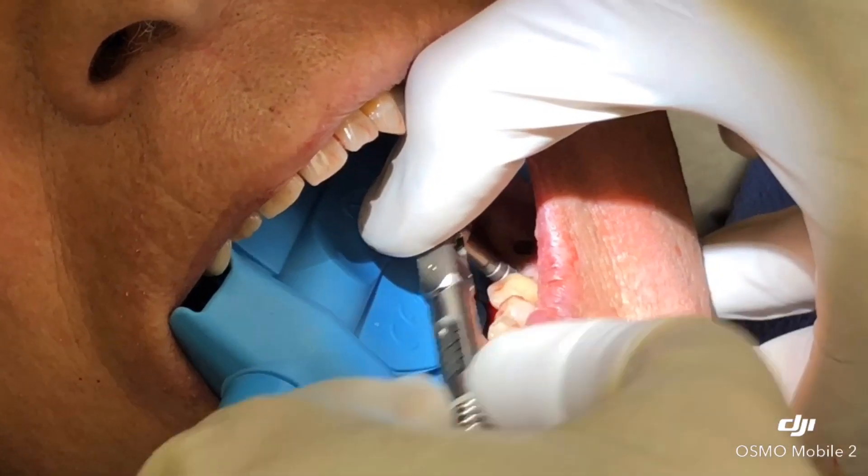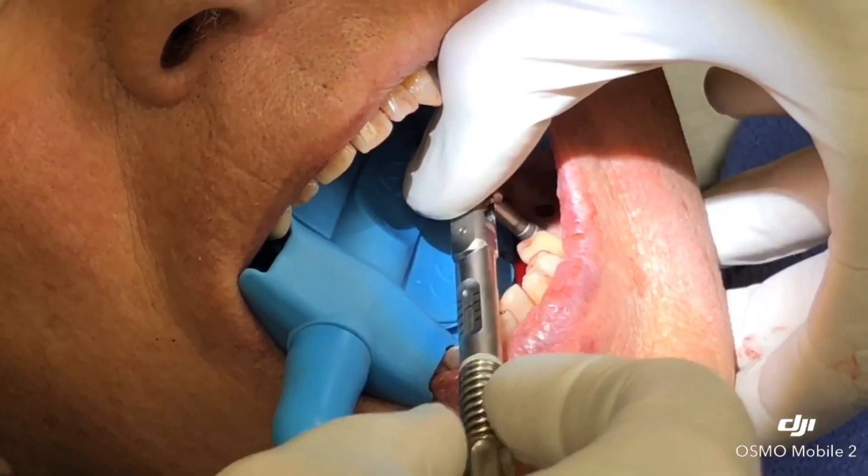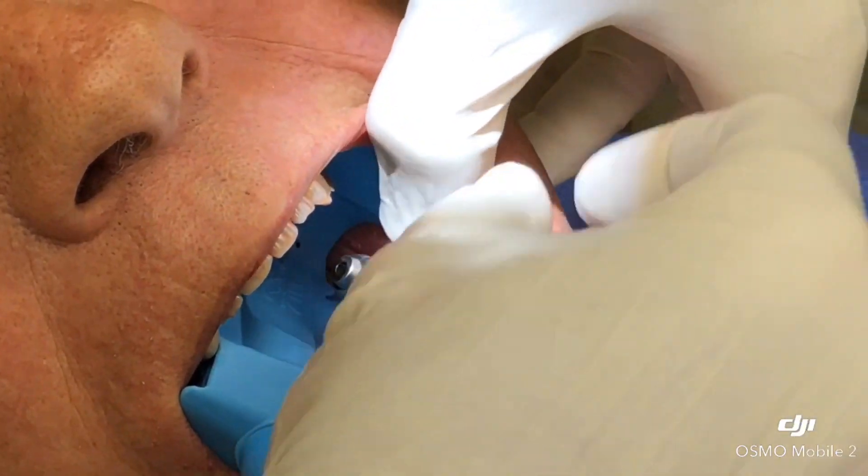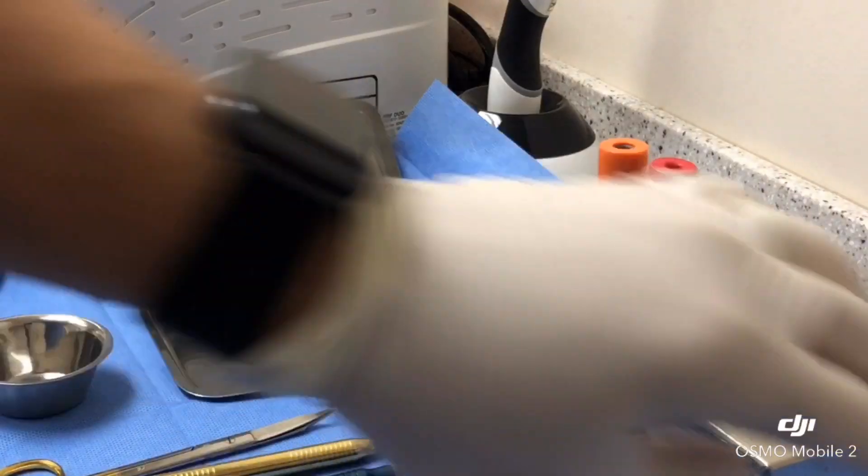This is not the implant — it is the tapping instrument, so we create a thread in the bone for the zirconia implant to engage.